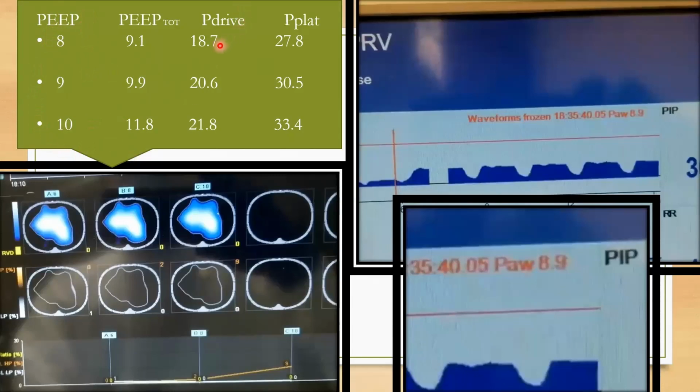So the optimal PEEP based on the ones that I looked at would be a PEEP of 8 with an intrinsic PEEP of 9. Over here, we have 6, 8, and 10. You see also, just like up here, that there's a jump when we went from 10, it jumped by 3 units of pressure. And you also see here with the PEEP study of PEEP of 10, you start seeing that trend where you're starting to lose compliance.